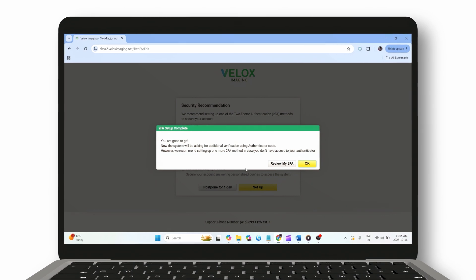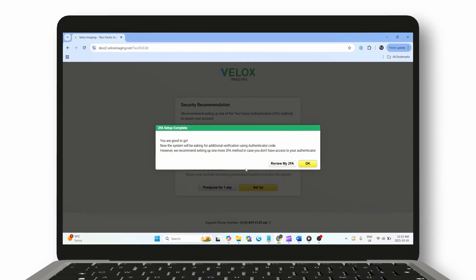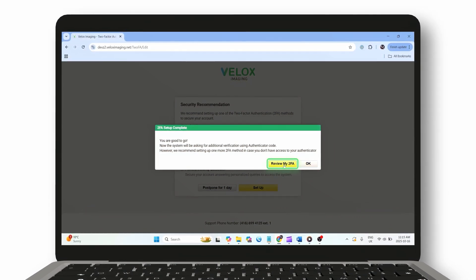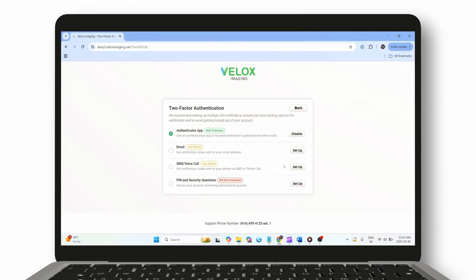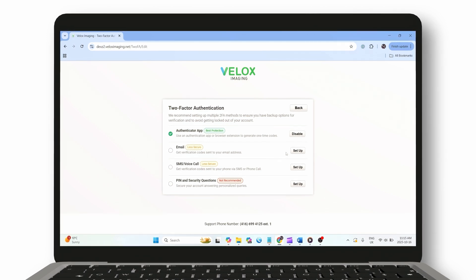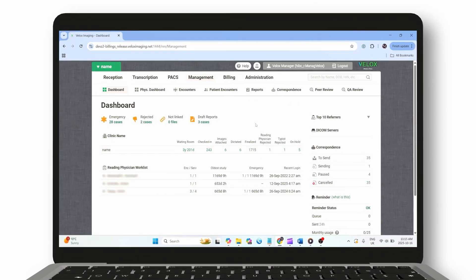If you'd like to set up an alternative two-factor authentication method later, click Review my two-factor authentication and choose another option. Or if you're ready to continue, click Back to return to your main dashboard.